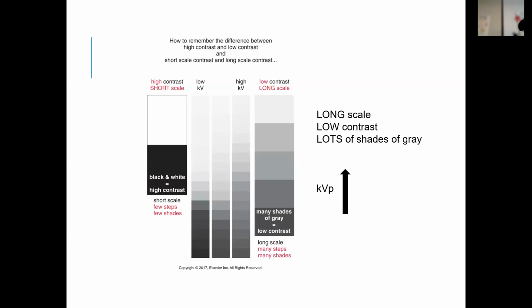Totally. Yeah. I mean, really, it's not like it's a hard concept. It's just that with so many long, short, few, high, it can get confusing, and I guarantee you it's on an exam. So you just have to play with it and write it out. My best advice would be write it out until you test yourself. Write it out over and over again until you have spit out the right story, or the right way that this works. I'm losing my words for that, but you know what I mean. But this is a really good slide for how to remember the difference between high and low and how the KVP has affected it. I think that kind of sums it up nicely.